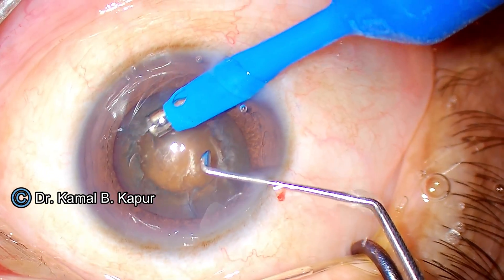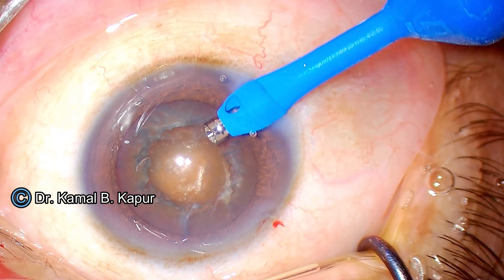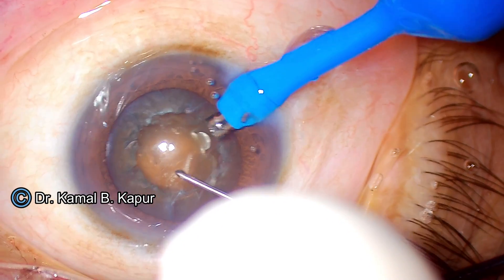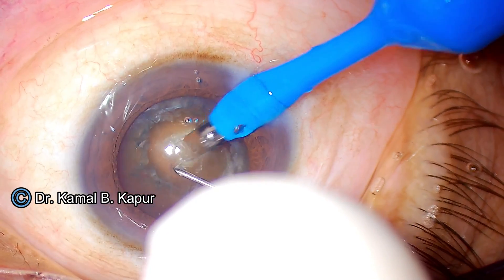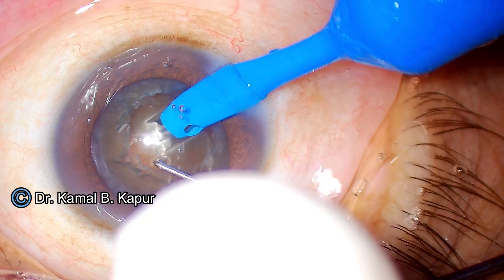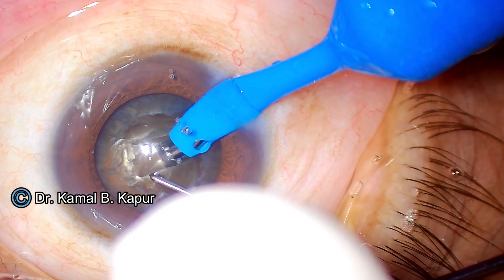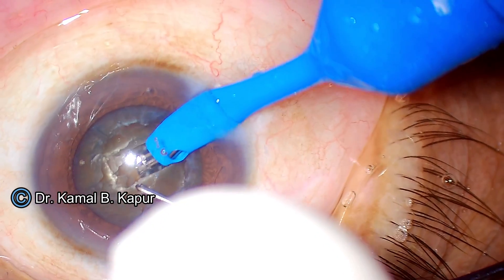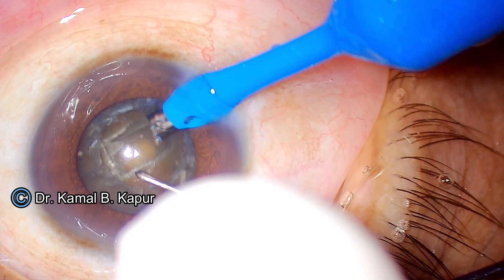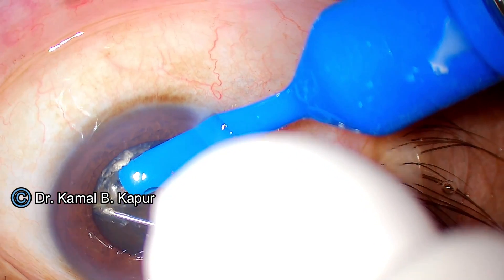Removing the cortical plate gives us a very good view of the roof of the nucleus. We then change to a sharper chopper. Making sure there is no pressure on the posterior side of the cataract, we create a broader trench — a broader trench is necessary here so that the sleeve can enter and we achieve adequate depth. If the trench is not wide enough, the sleeve will prohibit the phaco tip from getting embedded.